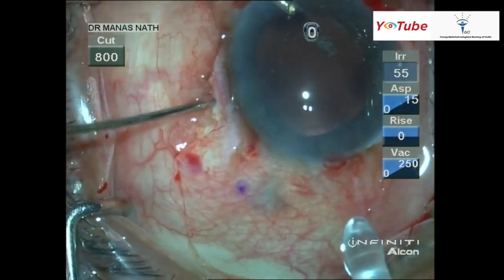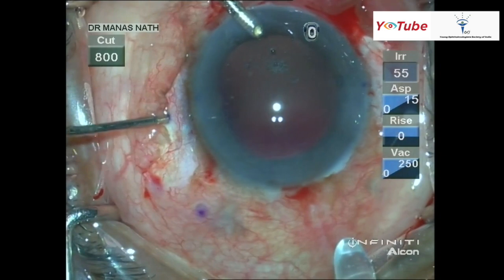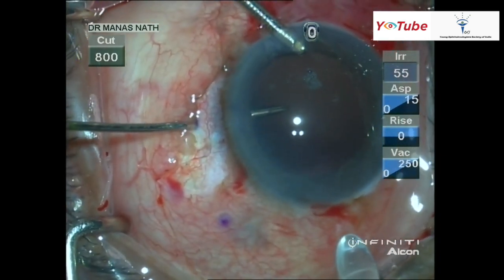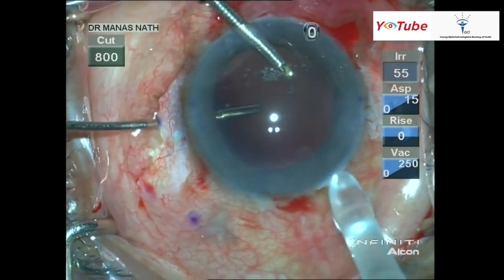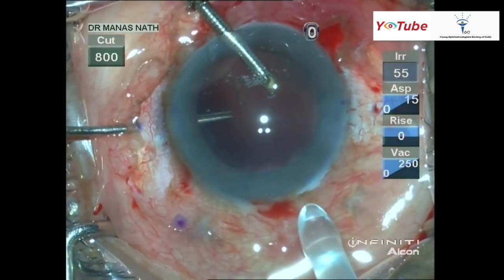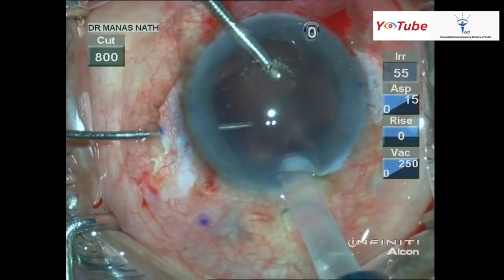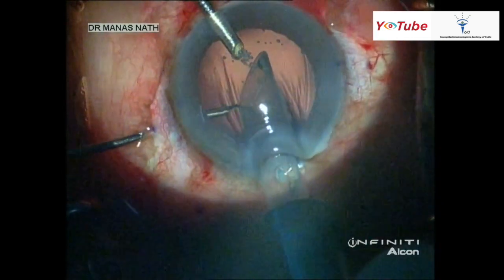The three-piece foldable lens is being loaded into the cartridge. Before insertion, I place the 25 gauge hand-gripping forceps inside through the sclerotomy — you can see the tip is slightly out so that it is easier to grasp the haptic with the forceps.